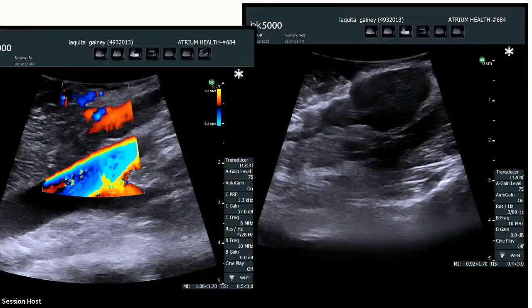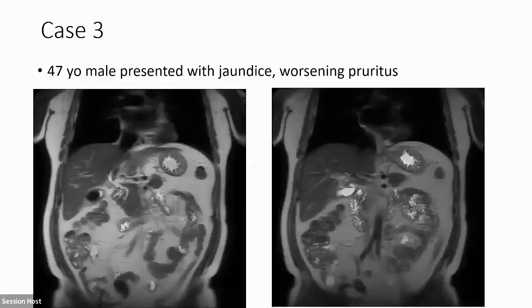So we used the ultrasound to help define the borders of what we were planning to resect and make sure that we're removing the entirety of the cyst. So the final path on that, as an FYI, it was indeed a mucinous cystic neoplasm. It was entirely resected. The path was benign on the liver lesions as well. So this is the last case that I have to present.